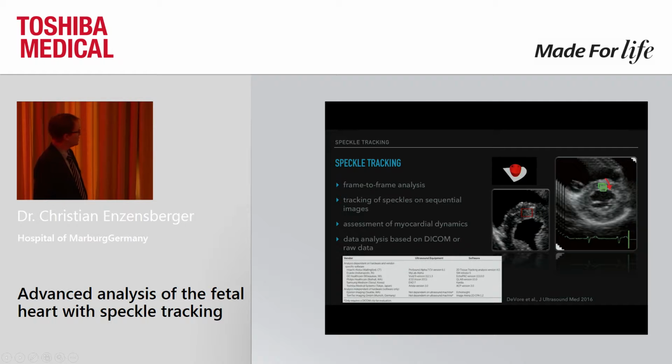As you can see in this table down there, there are different vendors which have this tool on board. There are several papers already published. More or less, when you compare these data, you notice that they are not really comparable. That's one of the main problems. But we'll focus on the wall motion tracking we worked with the last years, based on the Toshiba technology.